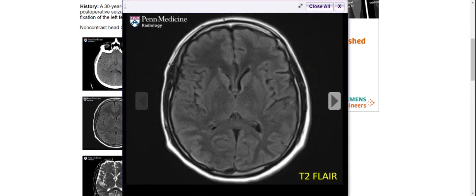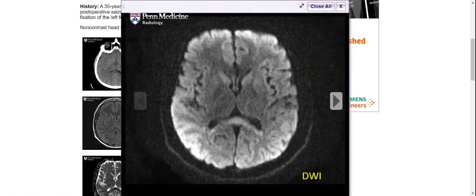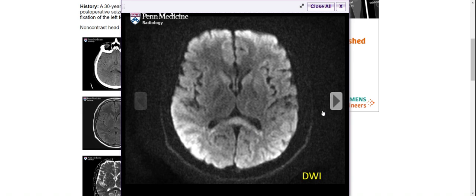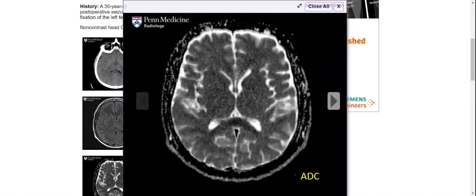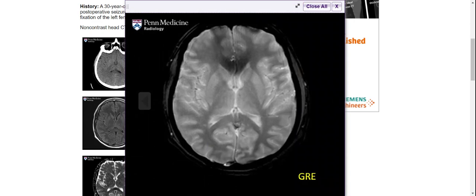Here is the MRI. On T2, we see a bit of hyperintensity of the splenium. On DWI, we see very marked hyperintensity of the splenium. On ADC, we see low signal intensity in the splenium. On GRE, there is also hyperintensity.